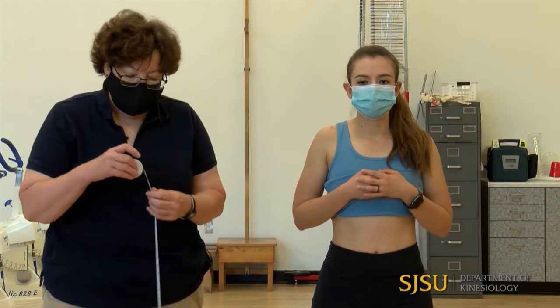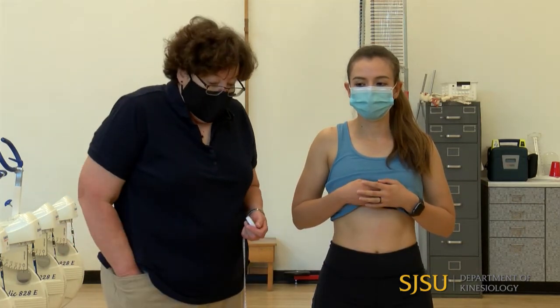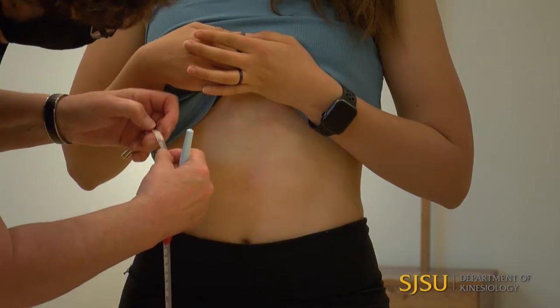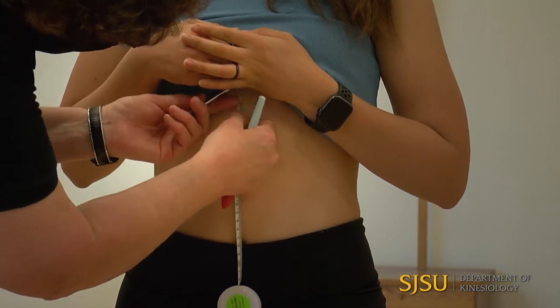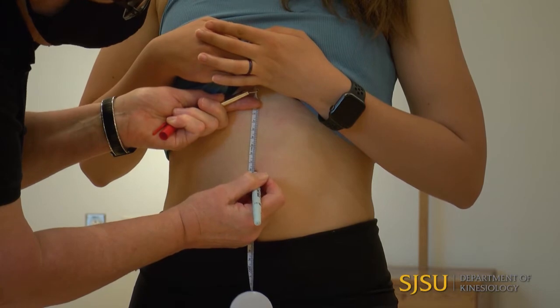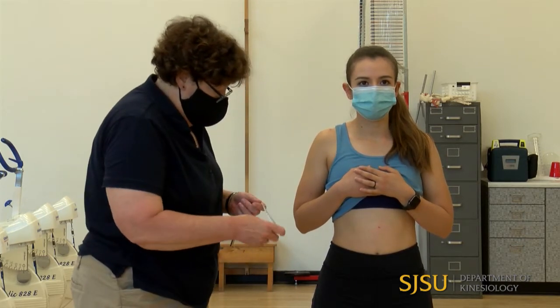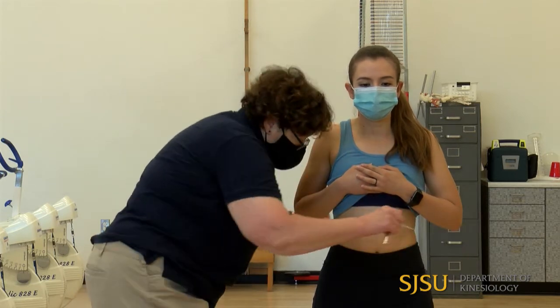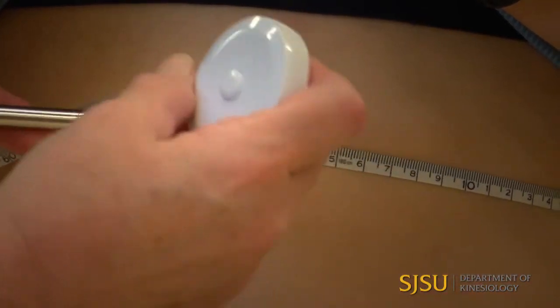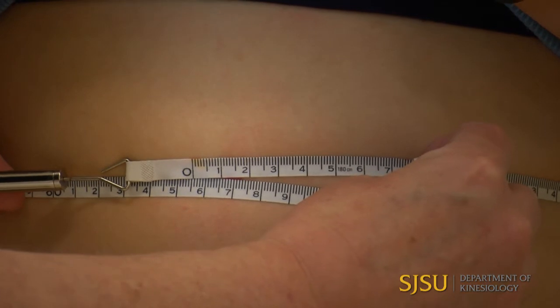There's a third abdominal measurement, which is kind of unusual. It's midway from the xiphoid process of the sternum to the umbilicus. So I need to measure and mark that — we don't eyeball it. You'll palpate the xiphoid process of the sternum going right down to the belly button. I have 16 centimeters, so I'm going to make a mark at eight centimeters. I go right around that mark, double check it's level in the back, pull it out to the point on the Gulick handle and take the measurement.